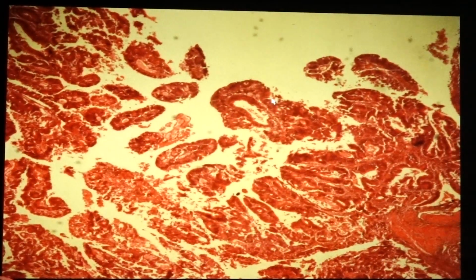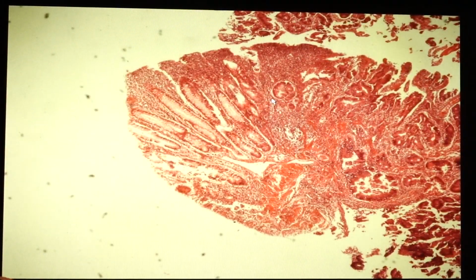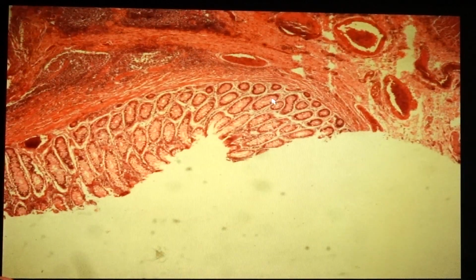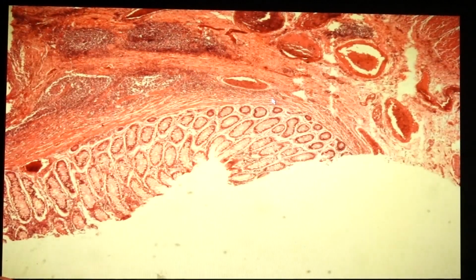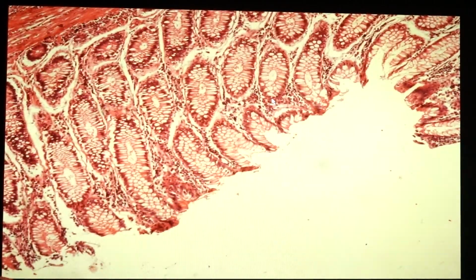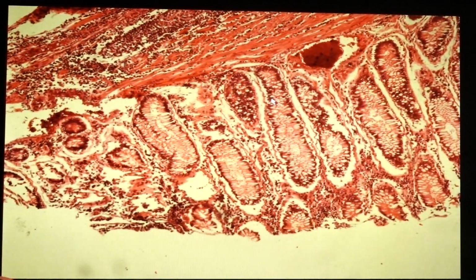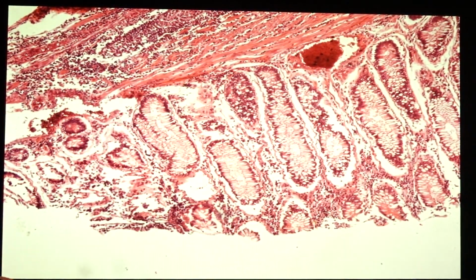So again, always when you are going to look at a slide, you always look for the lining epithelium. Okay. So in this case, because this is colon, you always would look for the presence of these intestinal glands. Okay, you would see the glands present with goblet cells. Okay, so there are a lot of goblet cells here. And then you do not see the presence of the villi. So this would be from the colon.